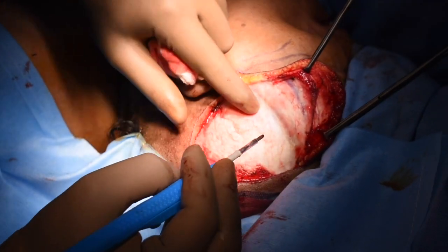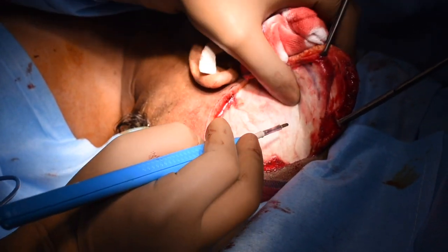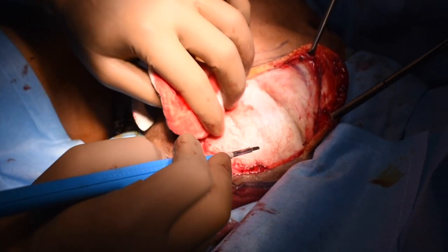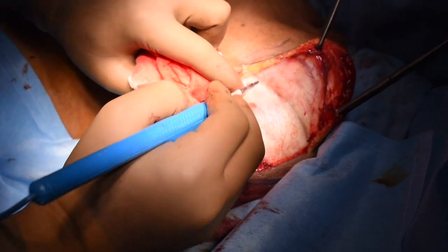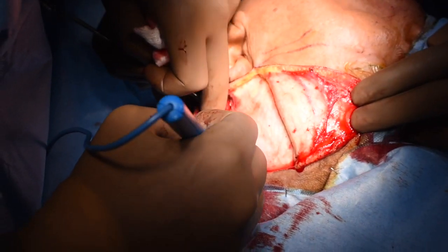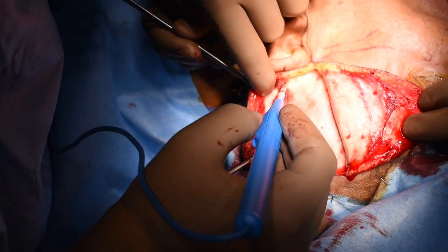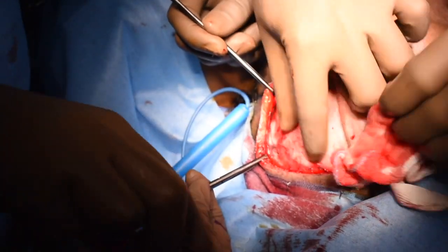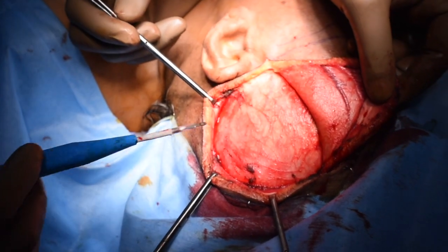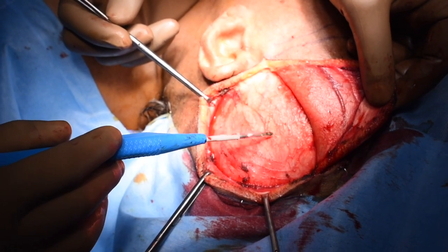Superiorly, the temporalis muscle is inserted onto the temporal line. The dissection is continued in all directions till the temporal line is reached. The entire temporalis muscle has been exposed now, and you can see the temporalis fascia and the underlying muscle.